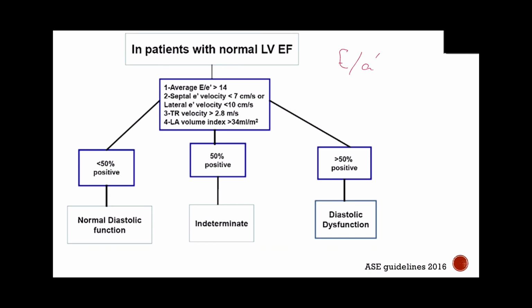And we're going to focus on this a little bit. It's because we're taking a look at the flow through the valve, comparing it to the movement of the tissue, okay? The flow through the valve is your E wave, right? And that's dependent on diastolic function, but also your preload, okay? Whereas in patients who have diastolic dysfunction, your E prime wave is only dependent on the actual diastolic function of the tissue and is not preload dependent, it's preload independent. Again, only in patients with diastolic dysfunction.